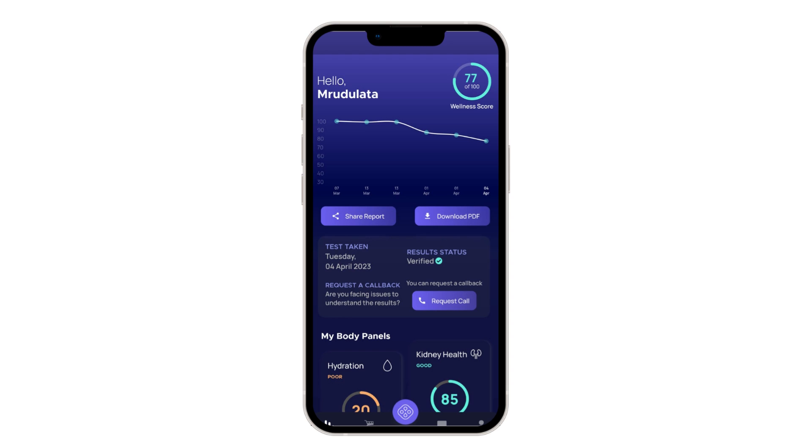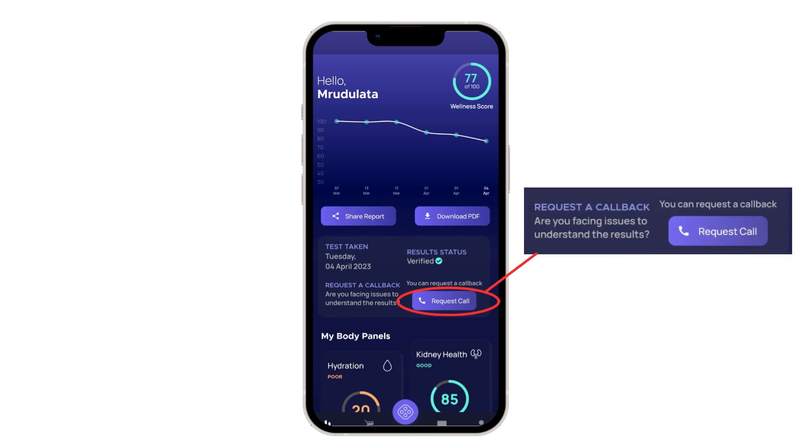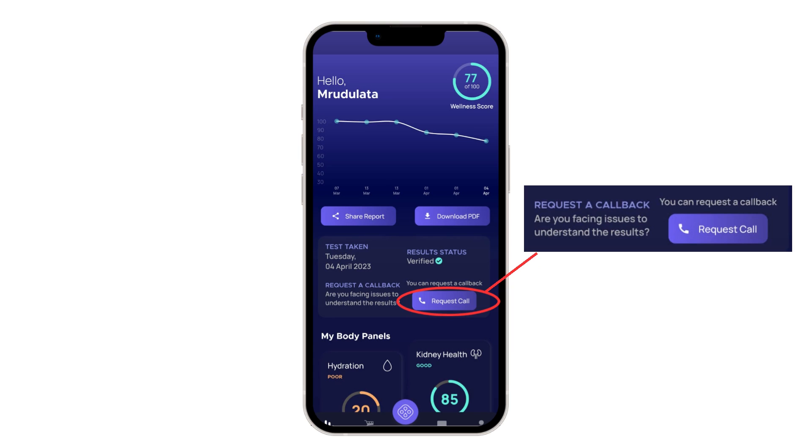Any delay in clicking the picture would lead to contamination of the test card. This is a one-time use test card. And you're done. This photo will get uploaded and you can see the results on your phone in 30 seconds with the same accuracy of a lab test. Tap on the request call button in case you have any doubts or require any medical advice. Our team will assist you with the process.